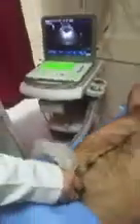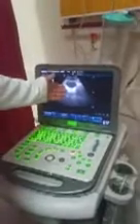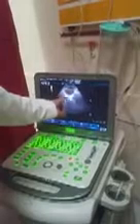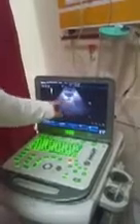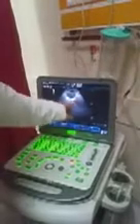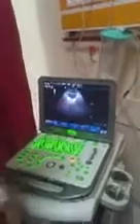And I am trying to catch free fluid at the rectovesical area, and I am trying to see if there is any free fluid posterior to the bladder. And this is the rectangular shape bladder, and this is the space that I am trying to use. I am trying to pick up the free fluid in this area.